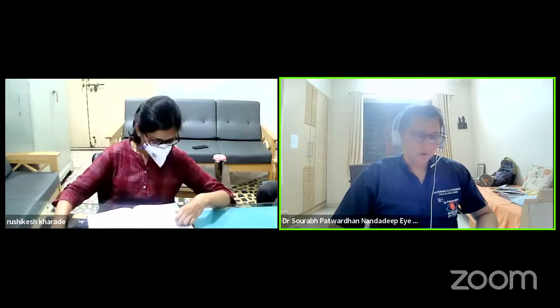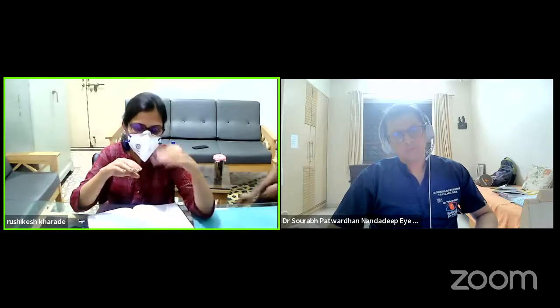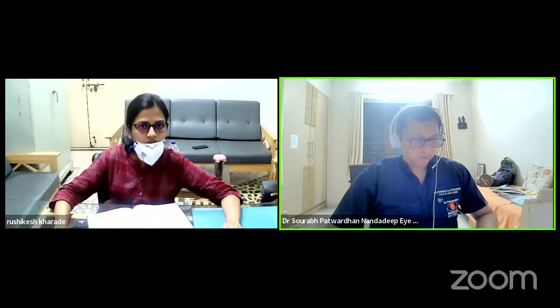The pupil becomes small while chopping because the irrigation and our phaco probe both go below the pupillary plane, so the pupil becomes smaller again and the iris starts prolapsing. That should not happen because of the chop as such.